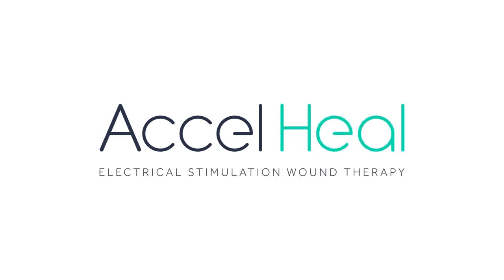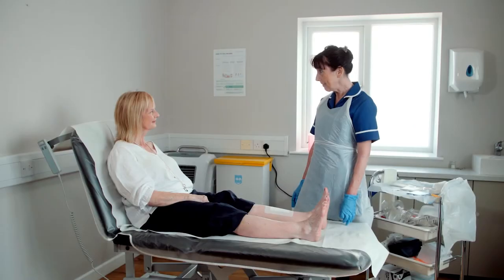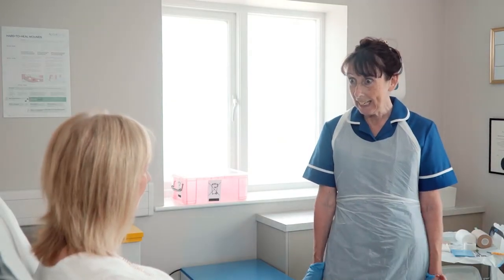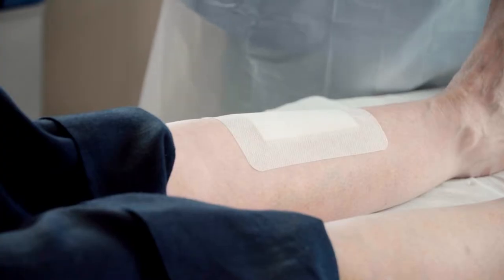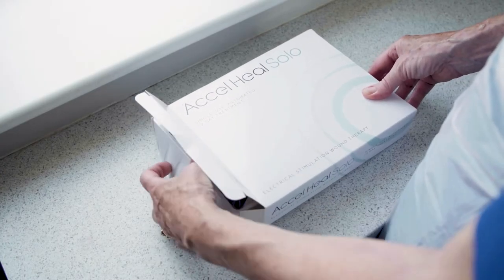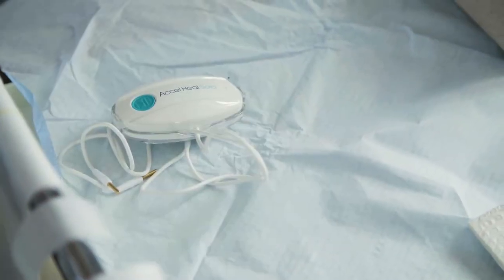This instructional film is intended to demonstrate the application of Accel-Heal Solo alongside compression bandages. Our process starts once the primary dressing has been applied to the wound. Make sure you have everything ready and close to hand to ensure an efficient dressing change for your patient.